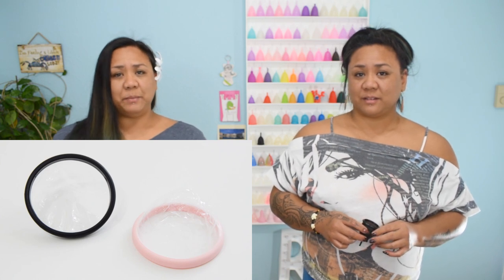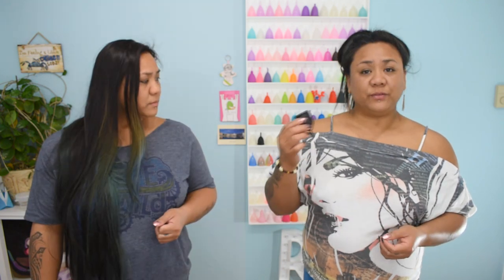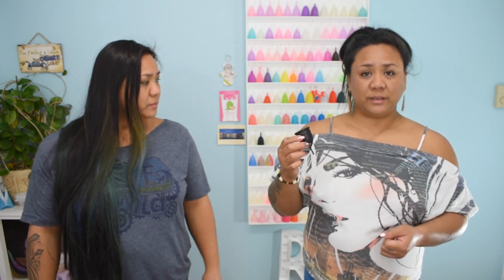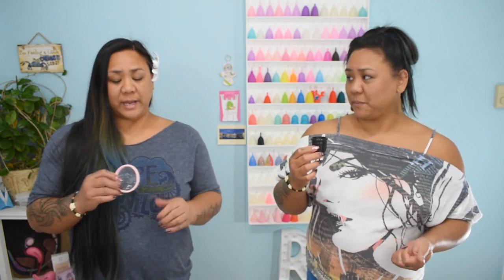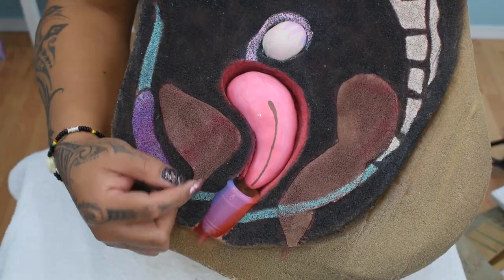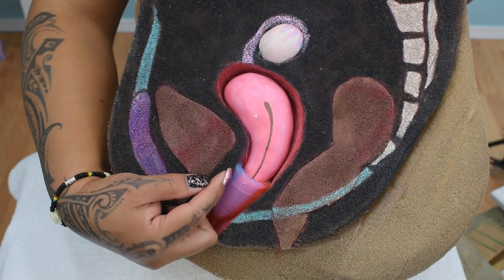Up until now, a menstrual disc has only come in one size, and it may not be suitable for all since the diameter of the rim is quite large. You can fold a menstrual cup several different ways. Certain folds create a smaller insertion point, some people find that certain folds help them have a better grasp on the cup while inserting it, and others find that a specific fold helps a particular cup open up easier. A menstrual disc is only folded one way — pinching the center of the rim together, kind of like a taco.